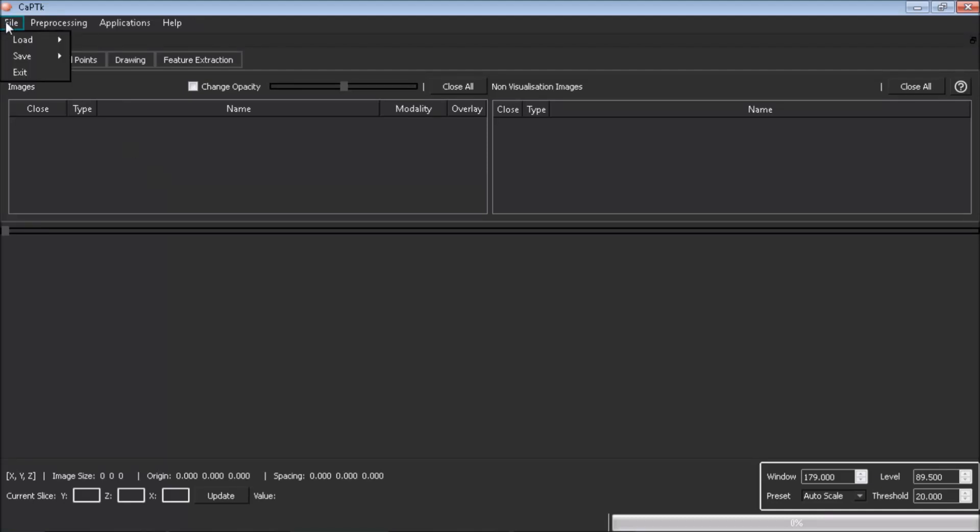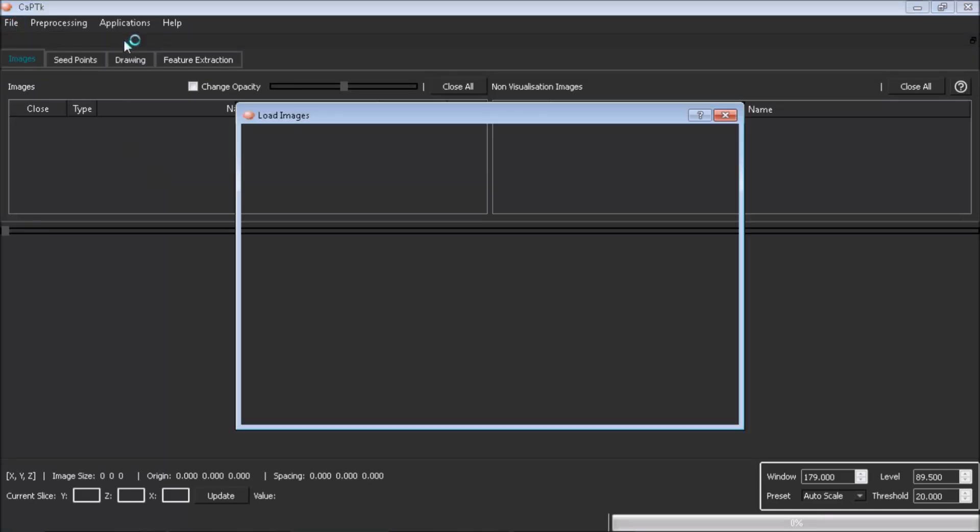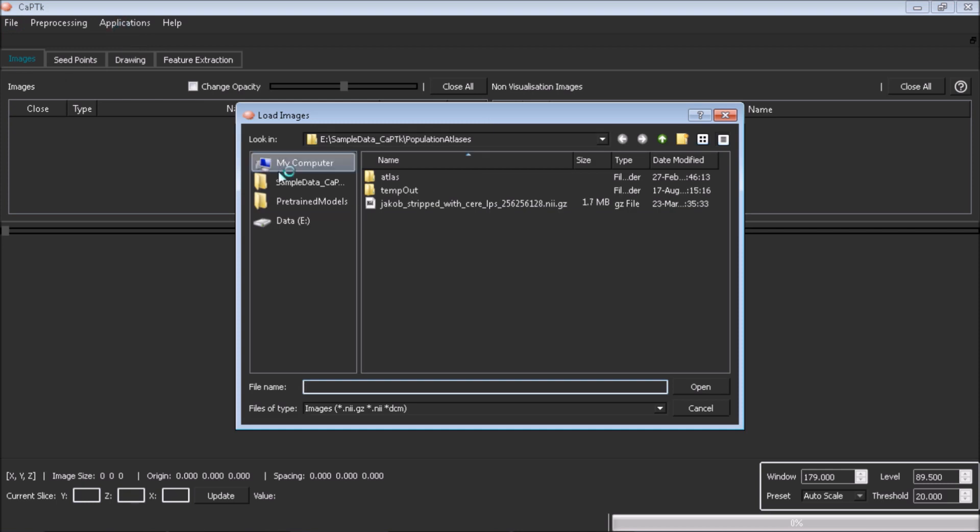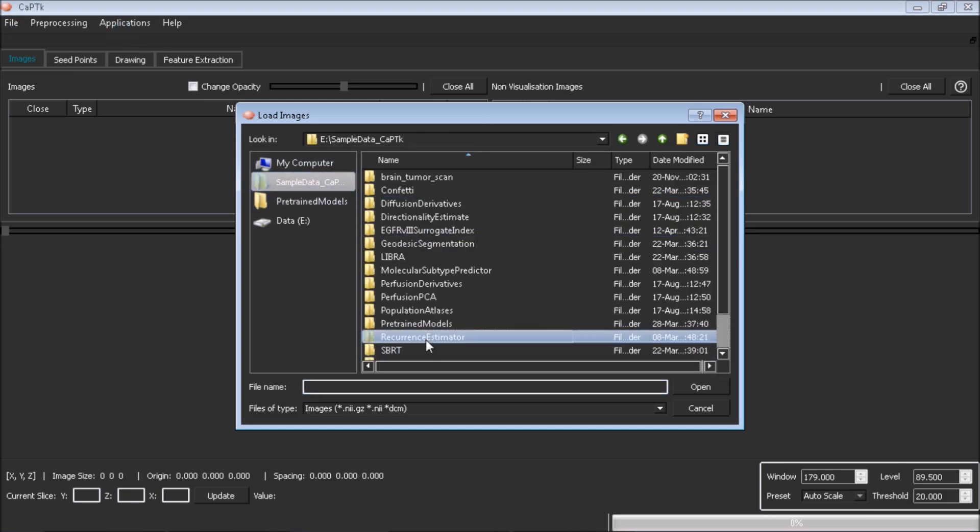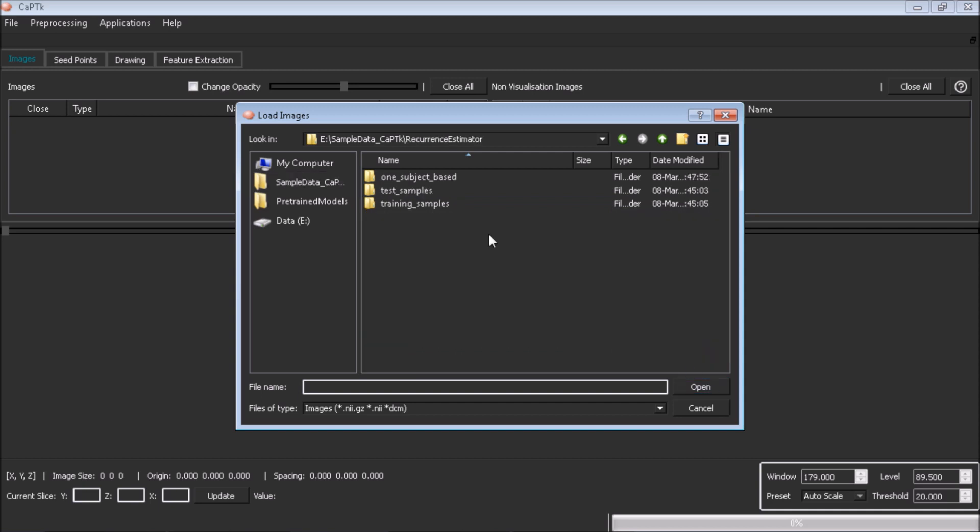This application provides a probability map of deeply infiltrating tumor cells in the peritumoral edema and invaded region that largely agrees with subsequent recurrence in de novo glioblastoma patients via multi-parametric MRI analysis. We will show infiltration prediction for a single loaded subject.